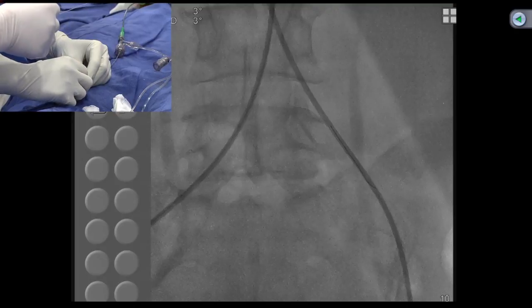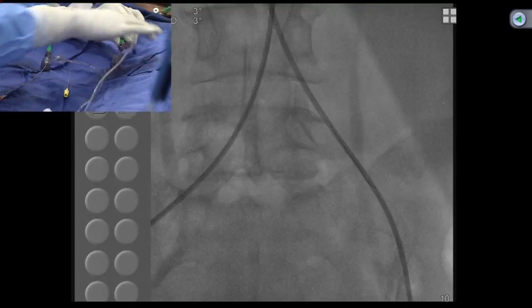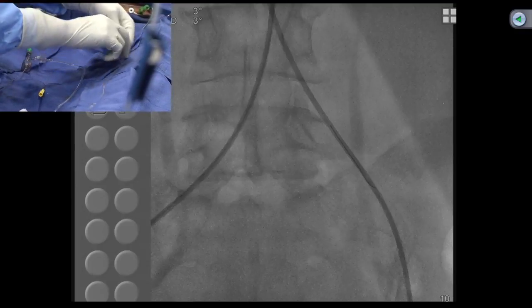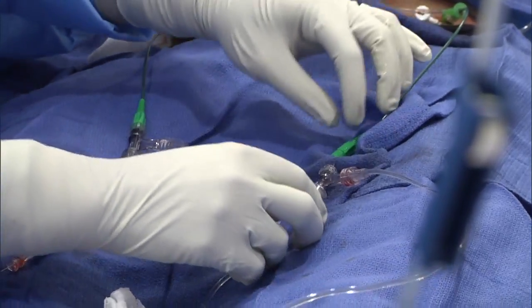Put the needle introducer there. So you take your Y connector, disengage that. Make sure we're showing the hand there, right? Yes, good, we are. We see it very nicely. Excellent job with the camera team there.